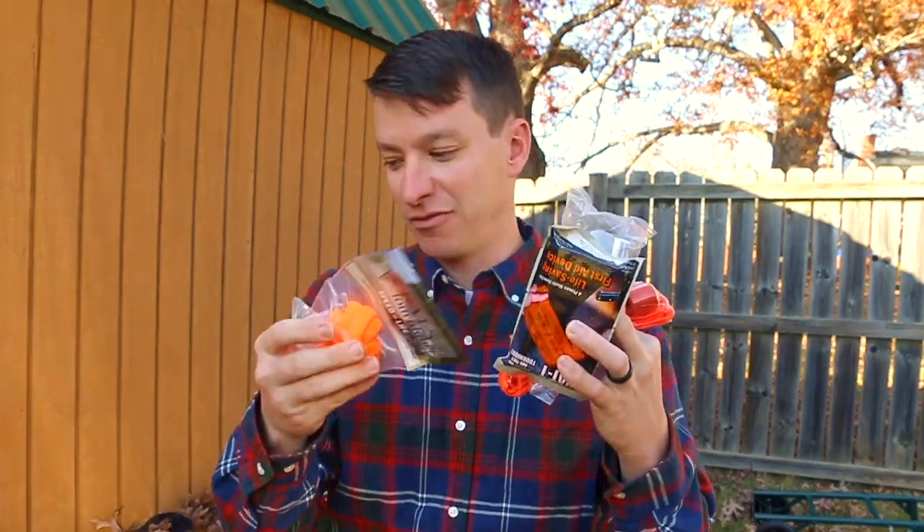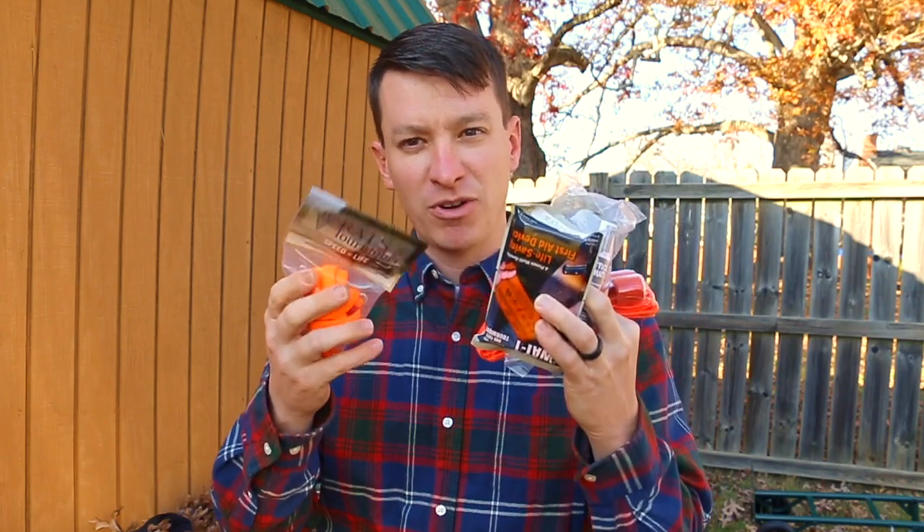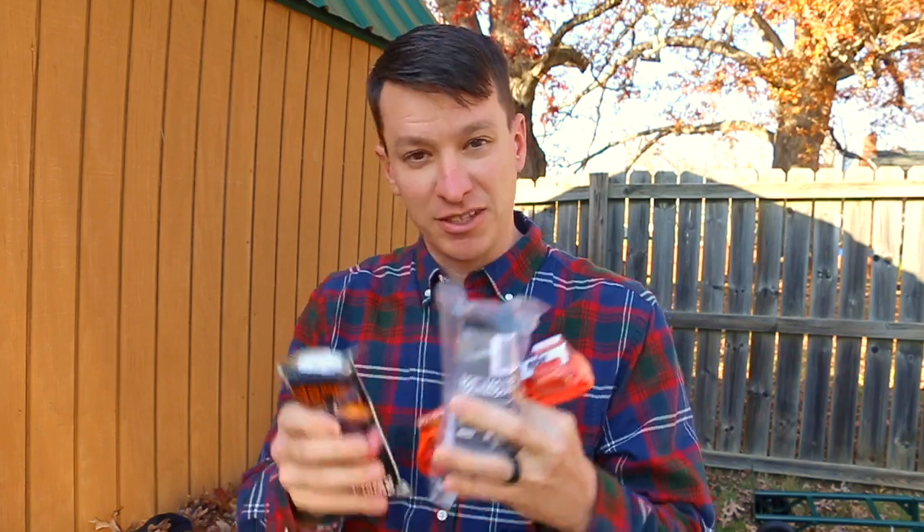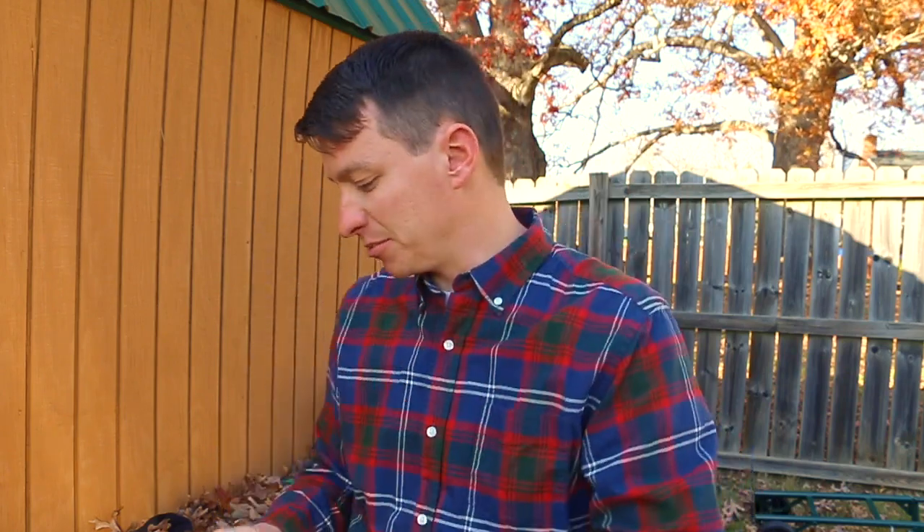Well, the problem is that you're going to be using this tourniquet in an emergency situation with a lot of blood. You don't want to be fumbling with trying to get the packaging open. This can be very difficult to open up at times.